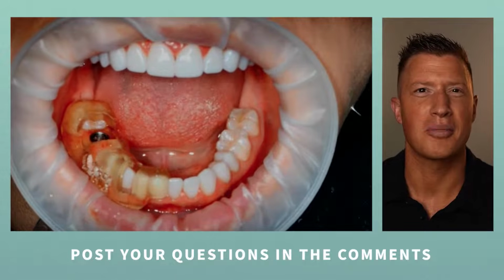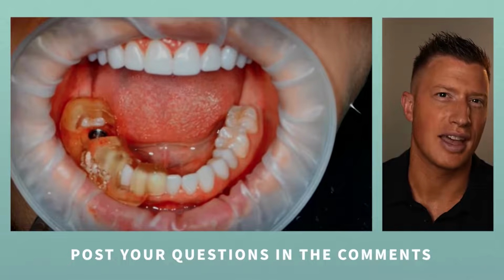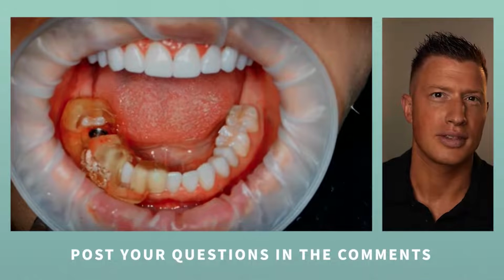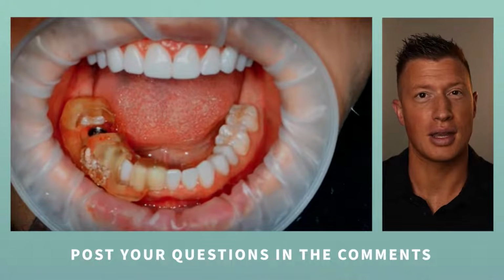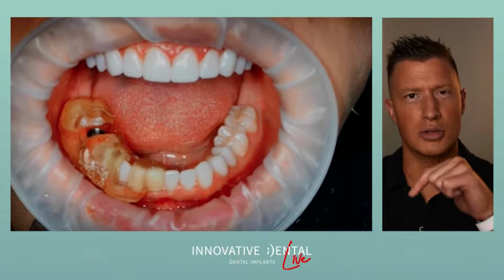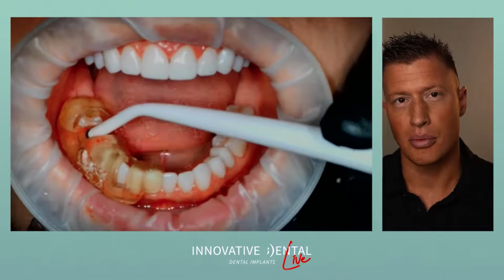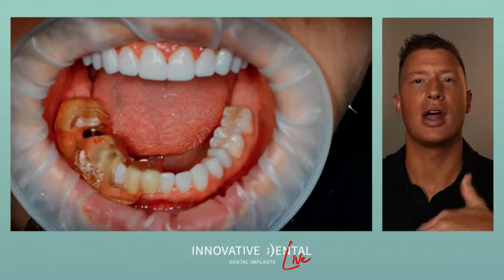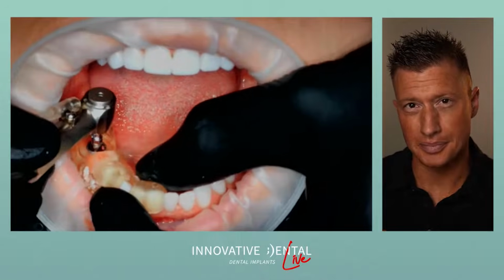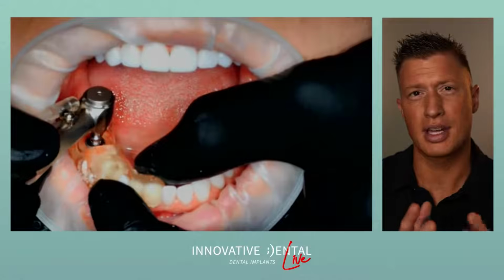You'll also notice my wife's got pretty bright white teeth. I did upper 10 and lower 10 veneers on her. So she's rocking some nice veneers. This implant crown will make the same shade. Stick around, I will show you how we don't just place the implant. We can take an impression, design the implant, and have it ready for our patient when they come back after healing. And healing time, typically I wait anywhere from 4 to 6 months, kind of depends on the patient.